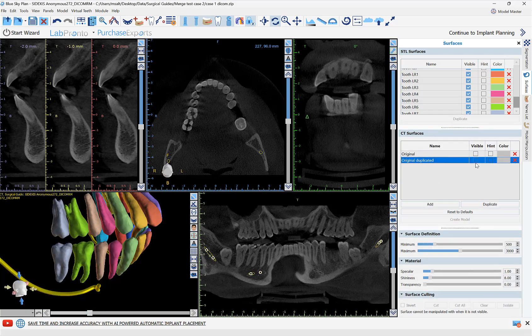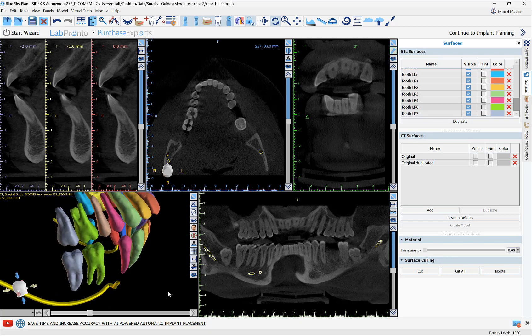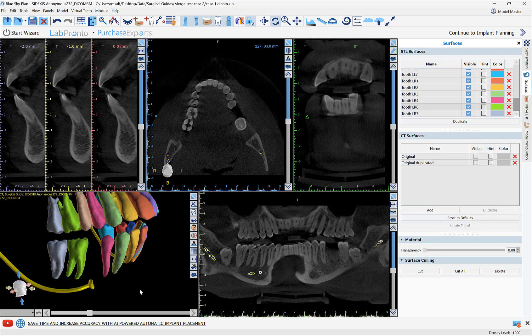The automatic CT tooth segmentation has been completed. We can see more clearly if we hide the actual CT scan — the tooth that we extracted previously is here as part of the CT data, but we can go ahead and either just hide it or click the red X to delete it completely.